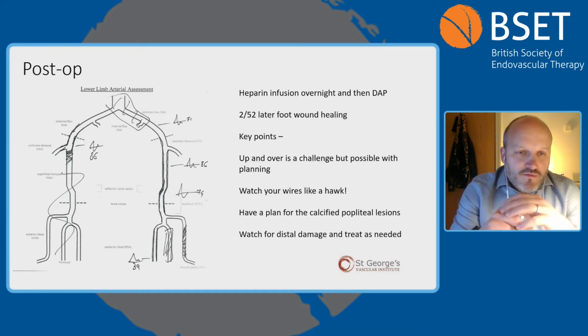I think the key points for me are: you can have a plan, but you need to have another plan in reserve. You need to have a plan B and a plan C. You need to watch your wires like a hawk, and your hard-earned gains can be lost very quickly by taking your eye off the ball. Watch your wires in terms of pulling your wire out, but also watch where the tip of your wire is, and watch what's happening. And that damage that we saw in the TP trunk was likely to have been wire damage.